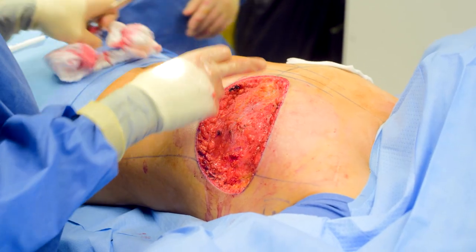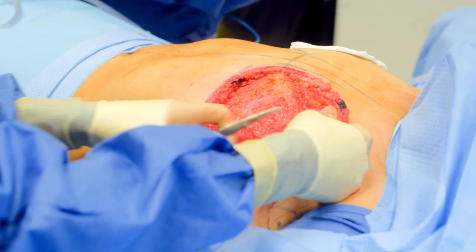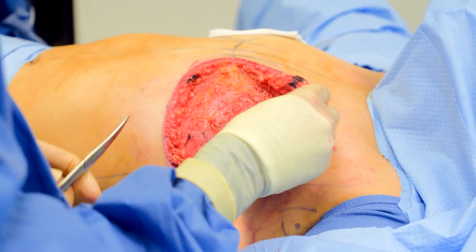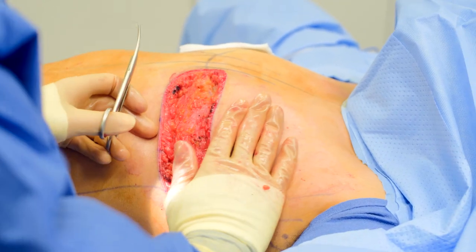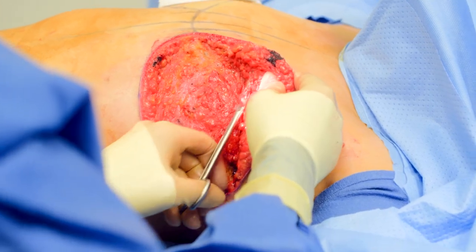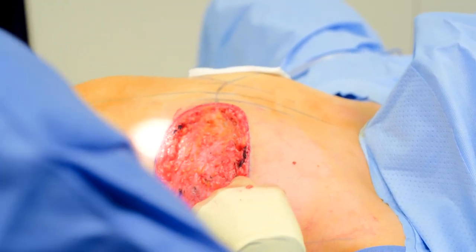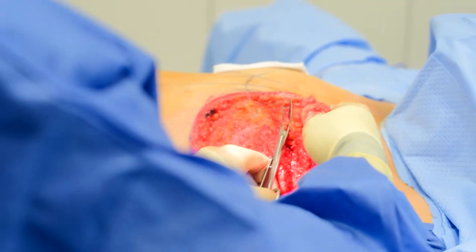I removed the breast on this side. Now what I'm going to do is go in and feel this and start contouring. This is really important to start shaping the chest. I go in and feel where I think it's still a little thick and want to thin it down to get a better contour, and I just trim it down until I'm happy — not just getting a flatter shape, but a more contoured shape. This is really an important step.